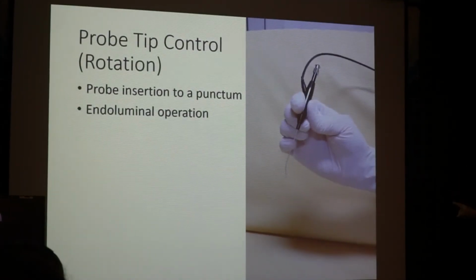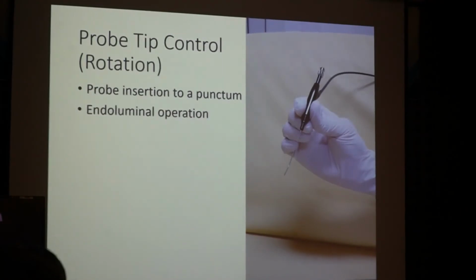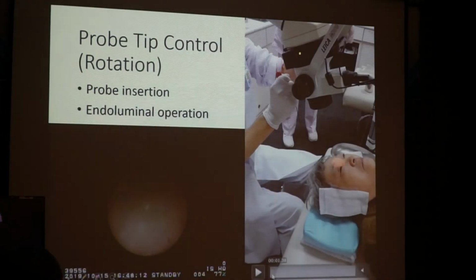This is very important and useful in the probe insertion to a punctum or in performing endoluminal operation. I can show you the example.